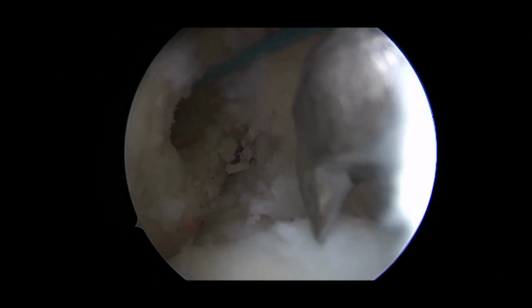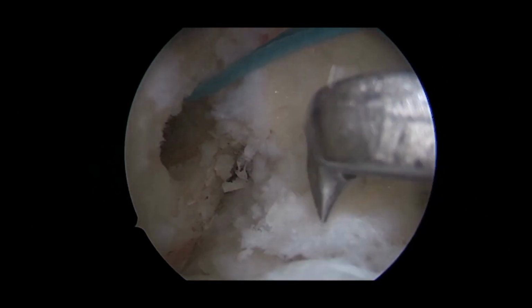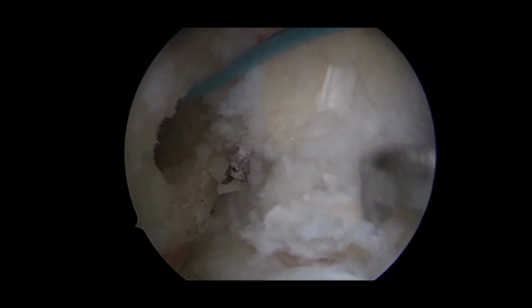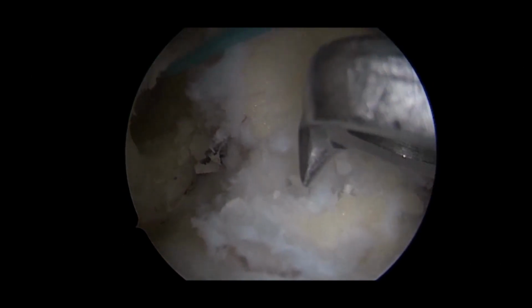Here I am cleaning all the soft tissue that is coming in my way with the help of a shaver in order to give clear space for our tibial jig. Friends, this is the anterior horn of the lateral meniscus. Just probing it and keeping our tibial jig just 2 to 3 mm posterior and medial to the anterior horn of the lateral meniscus.